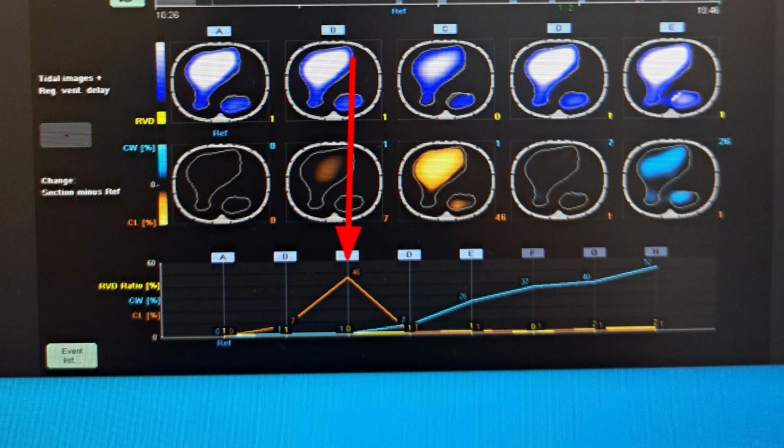Then I'll do a customized analysis. I'll look for any over distension, any improvement in compliance. Okay, there's over distension already shown when I went up from 30 to 36. I know I'm not going to do that. There's over distension. It's also important to realize when we're trying to reopen a lung, there might be a requirement to put a little bit of excessive pressure that will be a reading on my electrical impedance as a decreased compliance, and that will be a risk. It's saying, oh, there's a loss of compliance with this change. Is there over distension that you should be taking into consideration, right?